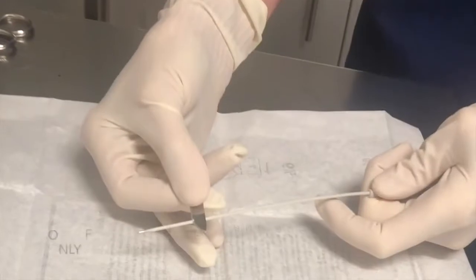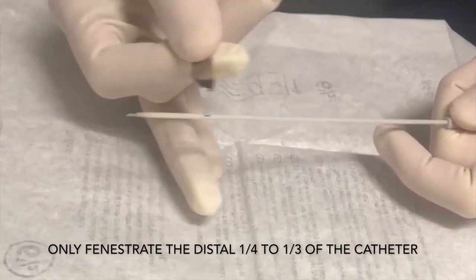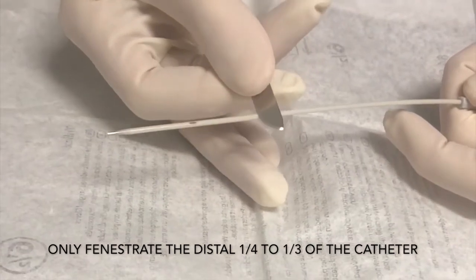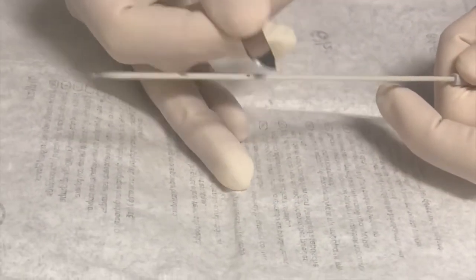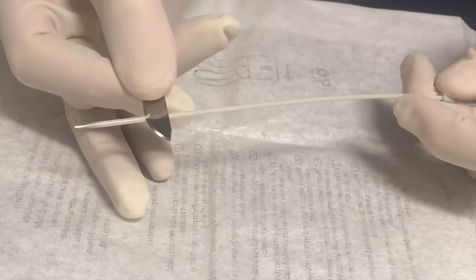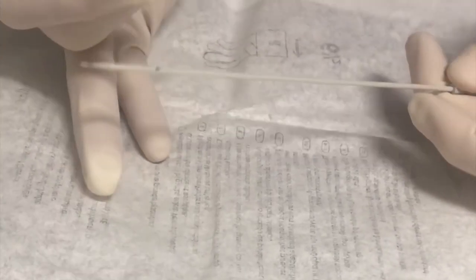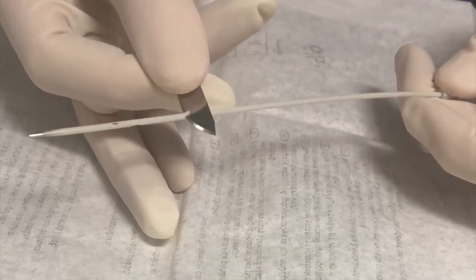Your assistant can then aseptically scrub the site while you put your sterile gloves on and begin to fenestrate the catheter. When you fenestrate the catheter, you leave the stylet in the catheter and make small apertures or windows in the catheter so that there will be less resistance to flow. Make sure that your holes are evenly spaced and small, and that you're not leaving any burrs in the catheter or weakening its integrity. You would not want a piece of the catheter to break off inside of the patient.